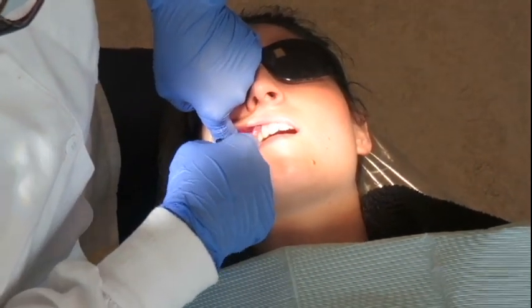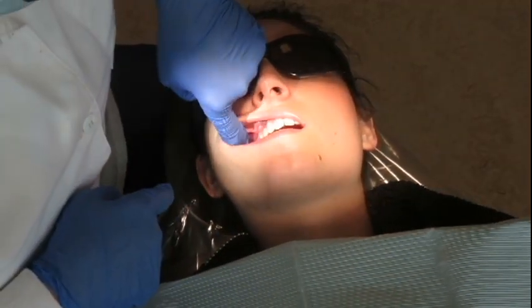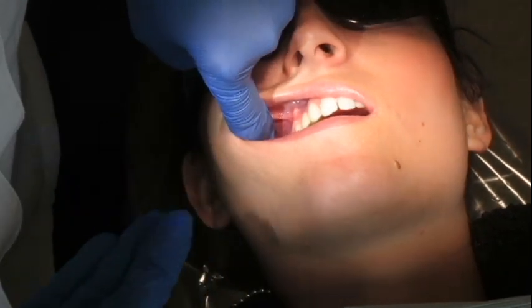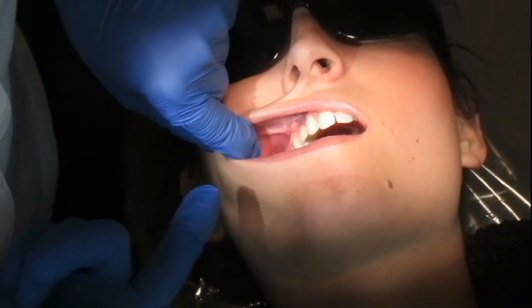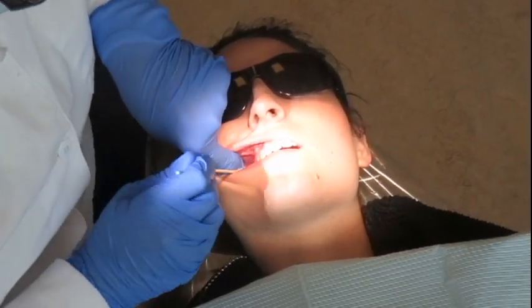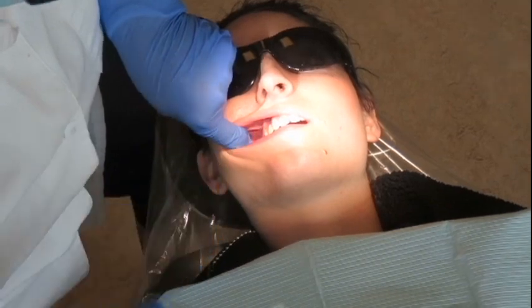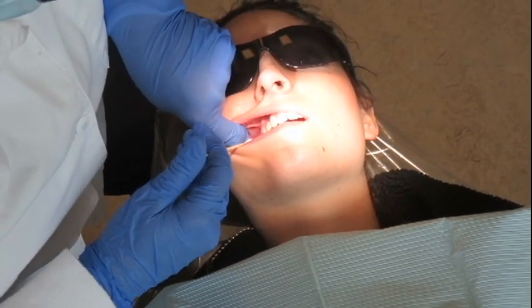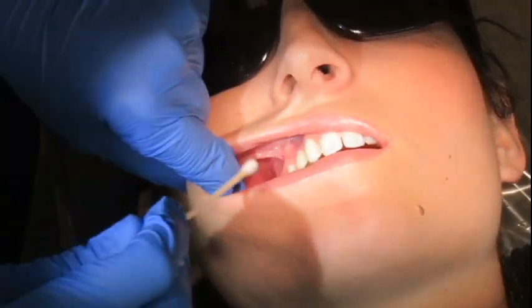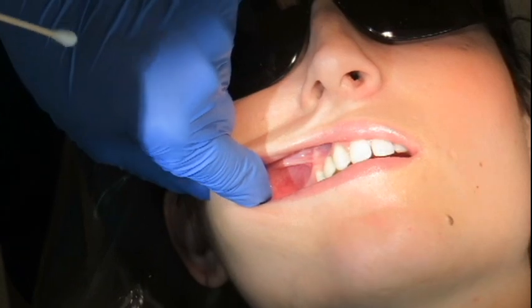I'm pulling out towards myself, but also pulling up towards the top of her head a little bit. Look at that site — it is really, really tight back there. What I see a lot of people do, because there's a knack to this retraction, is they'll reach back and pull, and then the tissue flops over the site and you can't see. So I'm holding my retraction nice and tight so that the site is very open and the tissue is taut. My site is way back here — you can really see it; it's nice and open. But if you just retract incorrectly, that tissue falls over the site and you'll be blind — you won't know exactly where that needle is going.